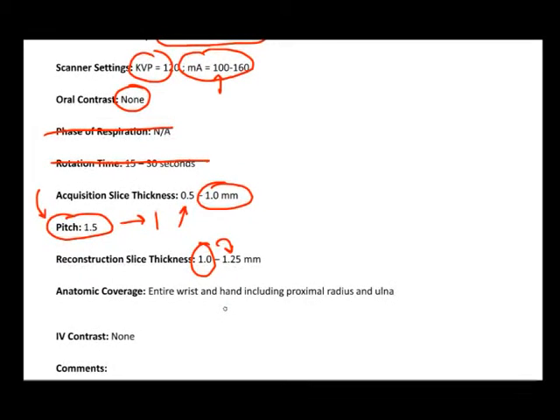Typically what we utilize is the patient laying prone on their stomach with their head towards the gantry and their arms extended and their hands extended as well. And many times we'll put a divider in between so that we can cause the most appropriate separation of the hands that we can, keep them at a certain level. Typically when you're utilizing a scan like this, you're doing both hands and both wrists so that the radiologist will have something to compare it to and also see if there's any inflammation in one side versus the other. And so typically we want to do bilateral extremities, not just one.